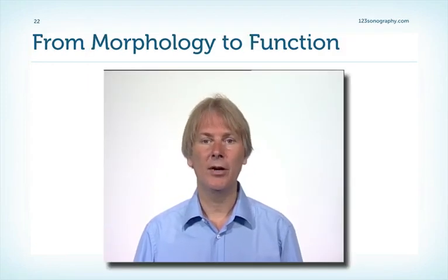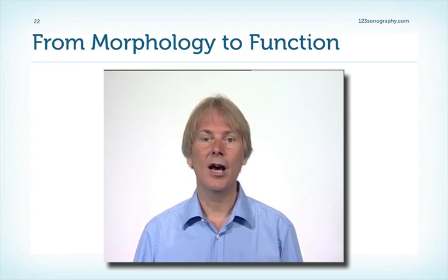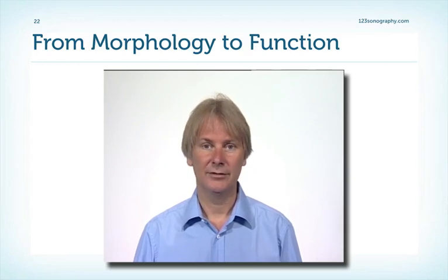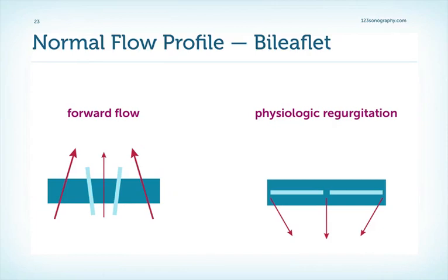The superb image quality of modern echo machines gives us a lot of morphologic and functional information about prosthetic valves. Up front, I would like to show you the typical flow profiles of the various prosthetic valves. First, the bi-leaflet valves: remember, we have three openings — two large and one small — so the inflow will show three jets. When the bi-leaflet valve closes, we have two types of physiologic regurgitation: first, the closing volume, where at the moment the leaflets close a bit of blood is pushed backwards, and then we have a bit of regurgitation at the rim or at the hinges of the leaflets.